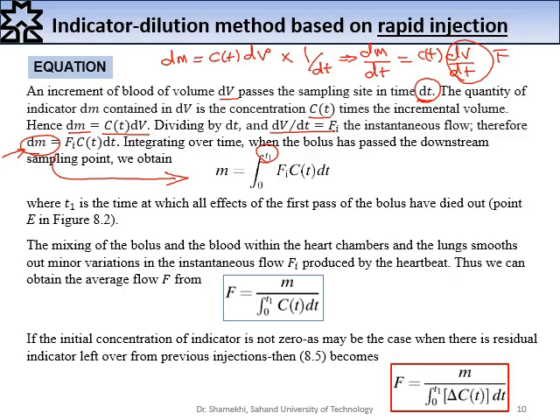This time is the time at which all effects of the first pass of the bolus have died out, point E in figure 8.2 from the book.